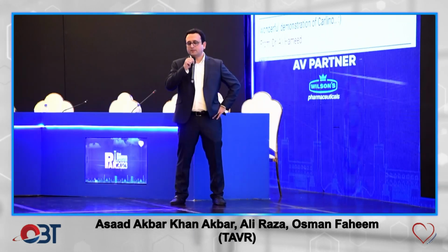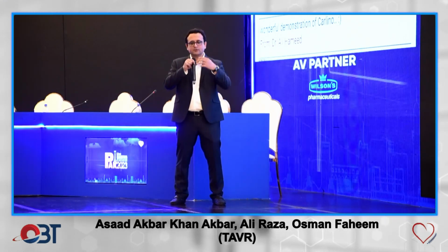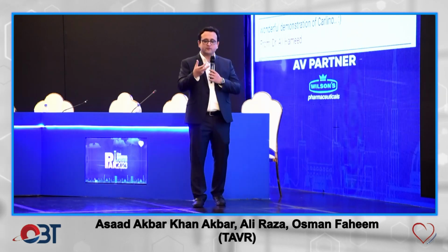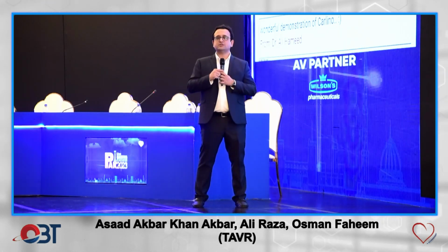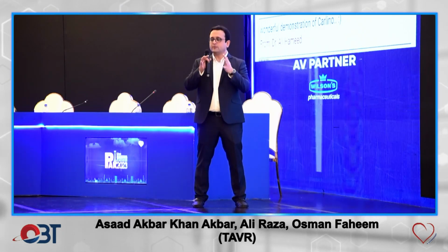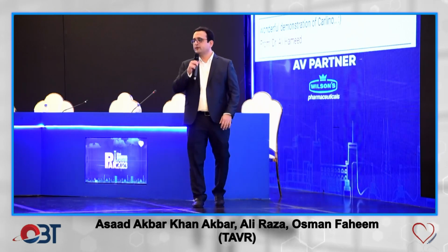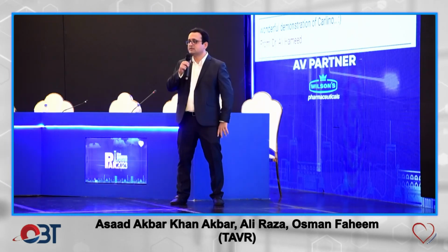Okay, it's probably the calcium which makes it non-stretchable. But one thing which I would say in addition to it, कि अगर आप 4 or 4.5 millimeter vessel में 14 French sheath डाल रहे हैं, तो you have to be very quick with the procedure because even though it will stretch, it won't cause a dissection, लेकिन there is no flow flowing into your leg. तो आप डाल के फिर बैठ के सोचने का टाइम नहीं है.